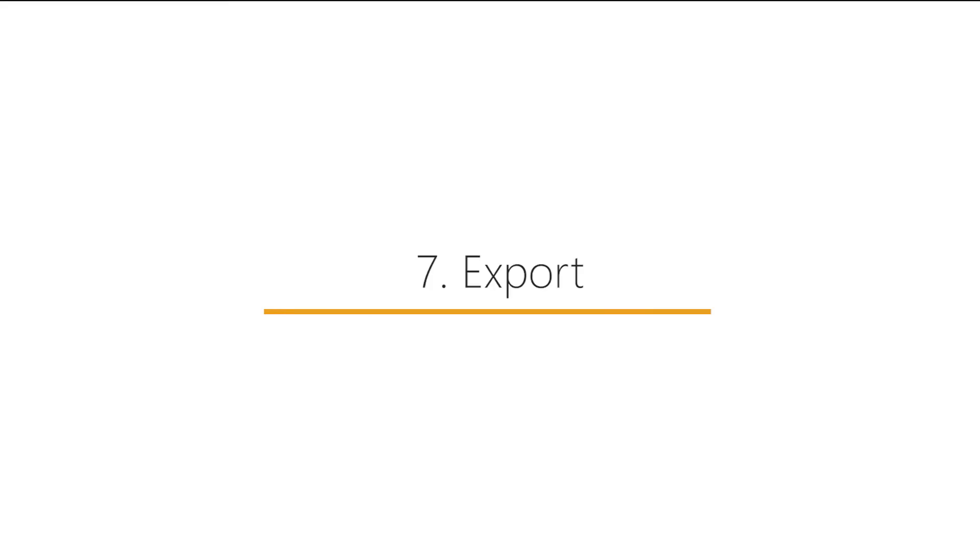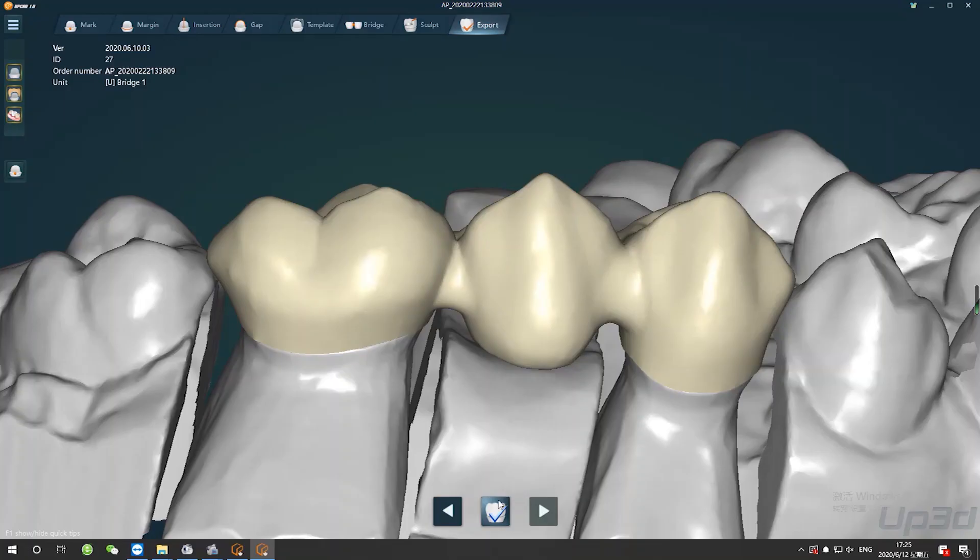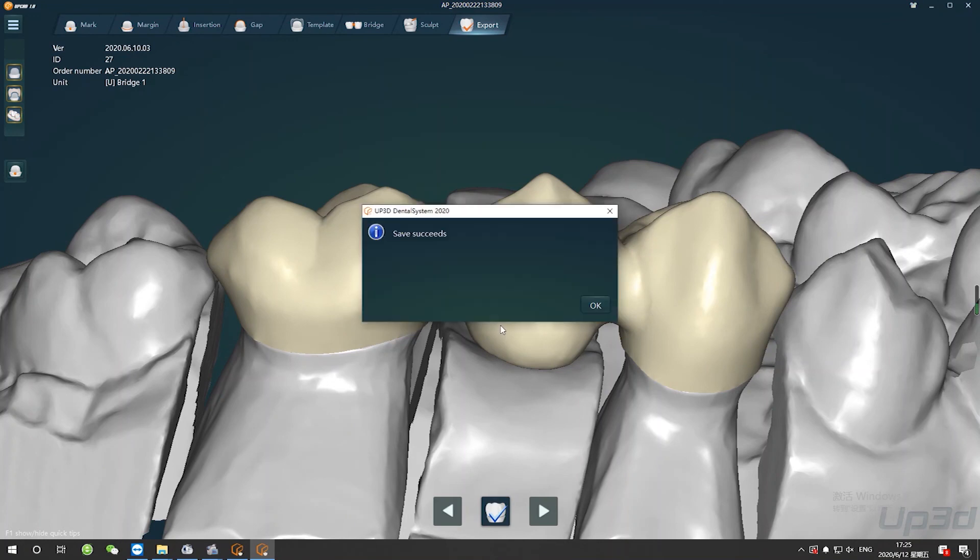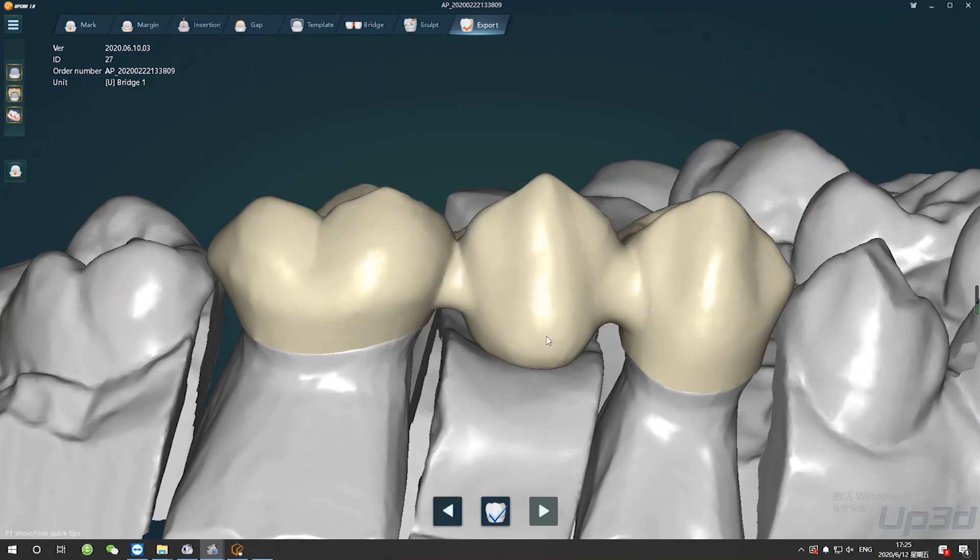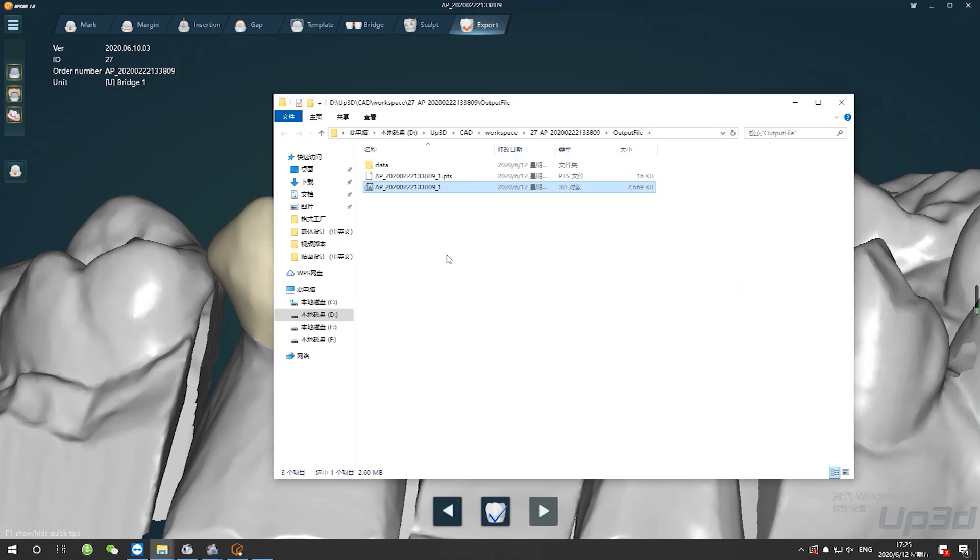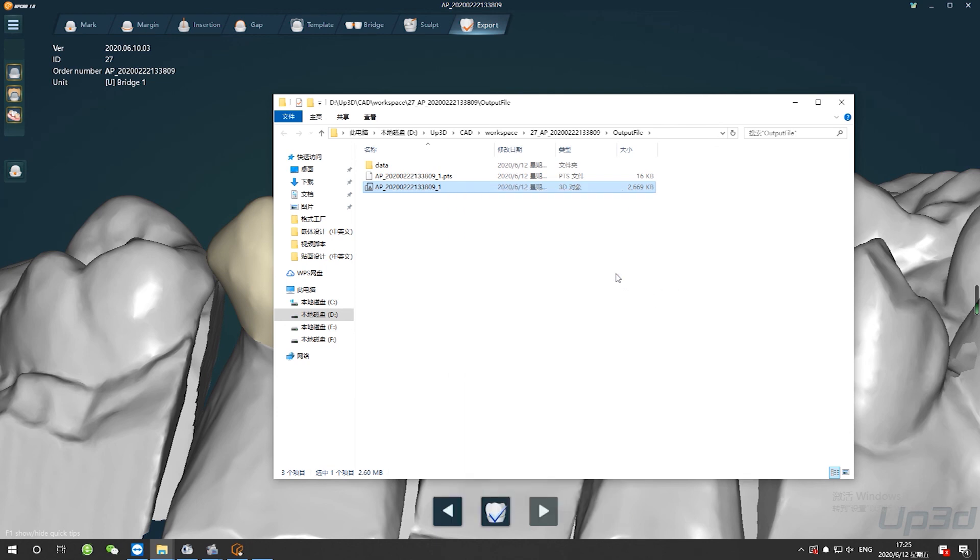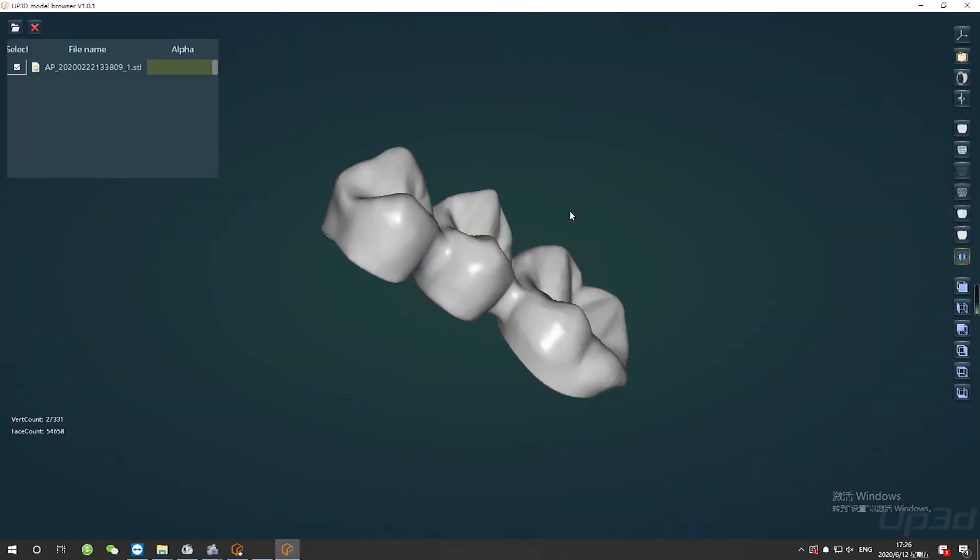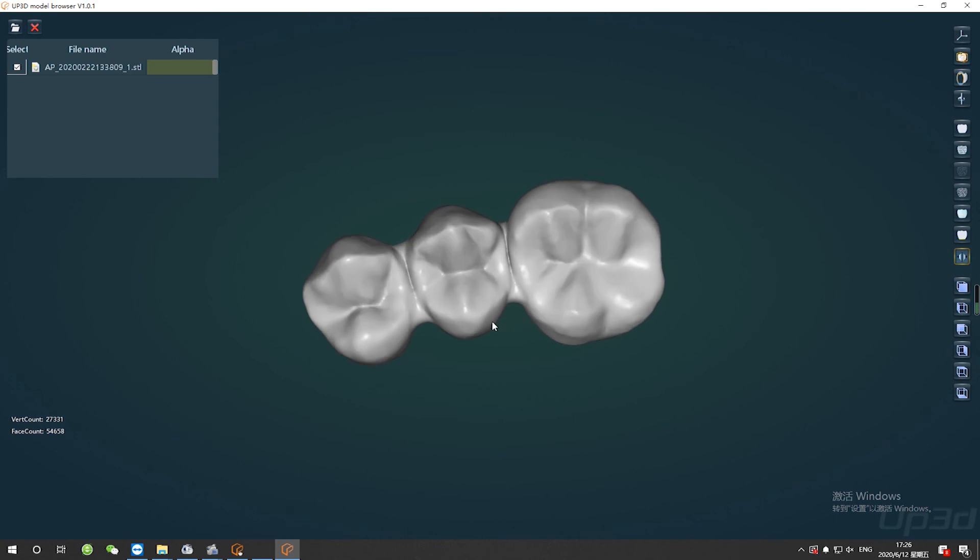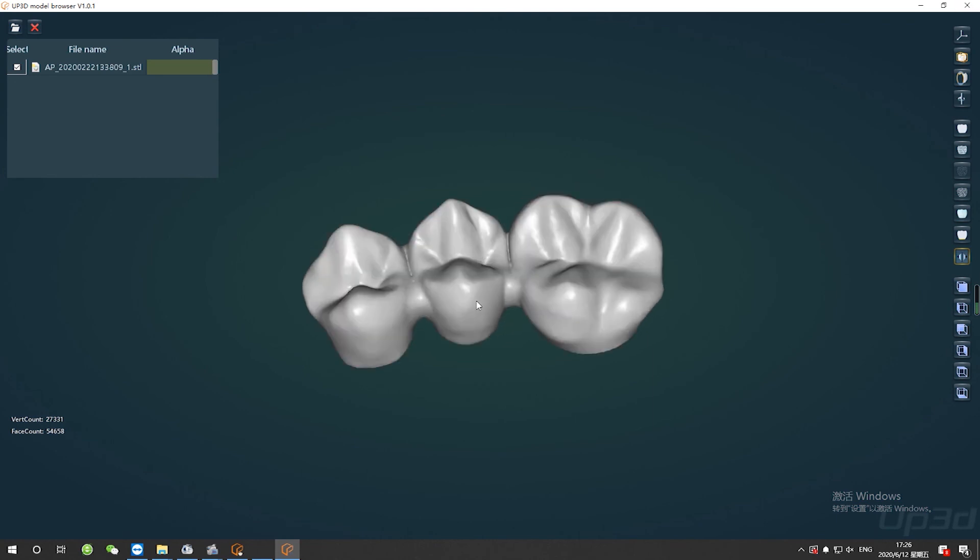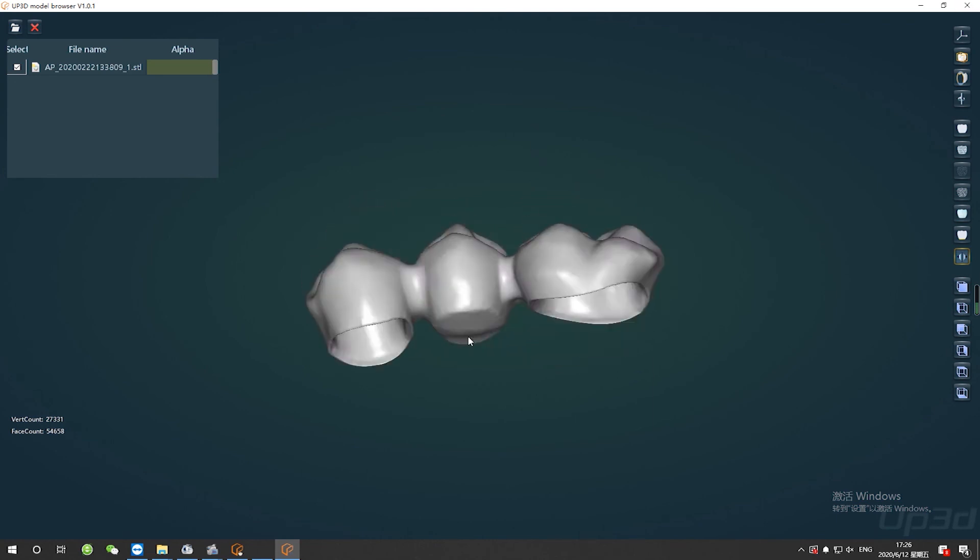Final step is exporting. Click complete to save the design of the bridge. The automatic pop-up folder display is restoration case data. STL document can be used directly for printing or nesting. Well, please have a try and enjoy your designing.